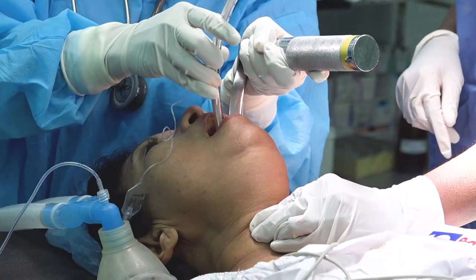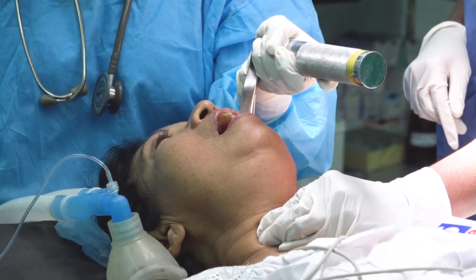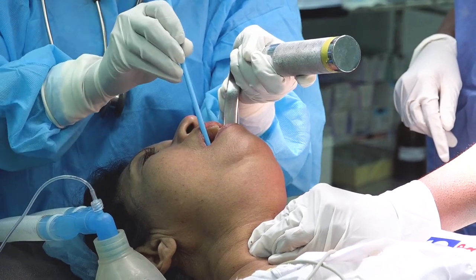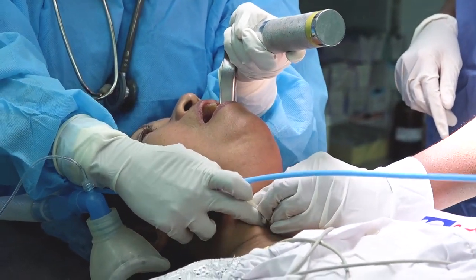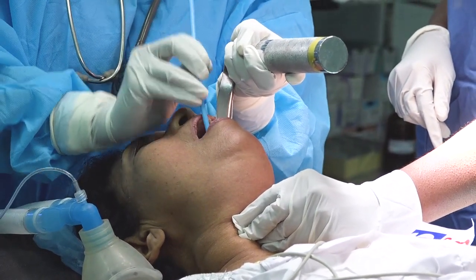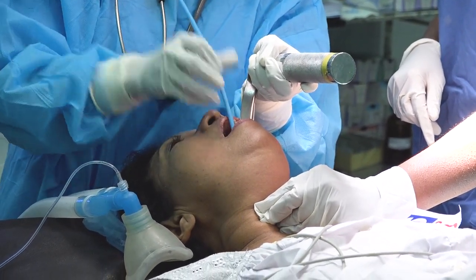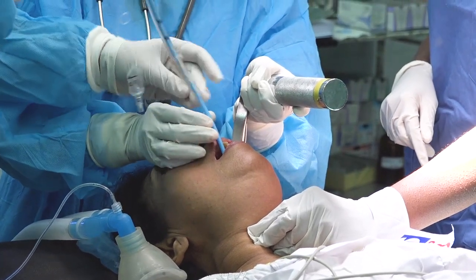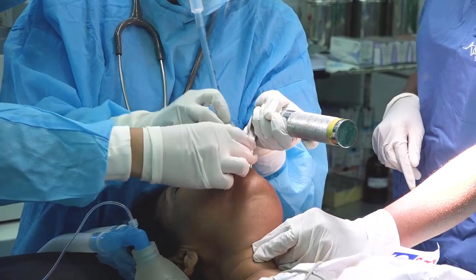If that method also failed, now you can do a further modification to your technique. Now you can try to pass a bougie into the trachea through the glottis and railroad an endotracheal tube down the bougie. If you have not been successful by now, since you are a trainee anesthetist, you should call for senior help or call the consultant now.